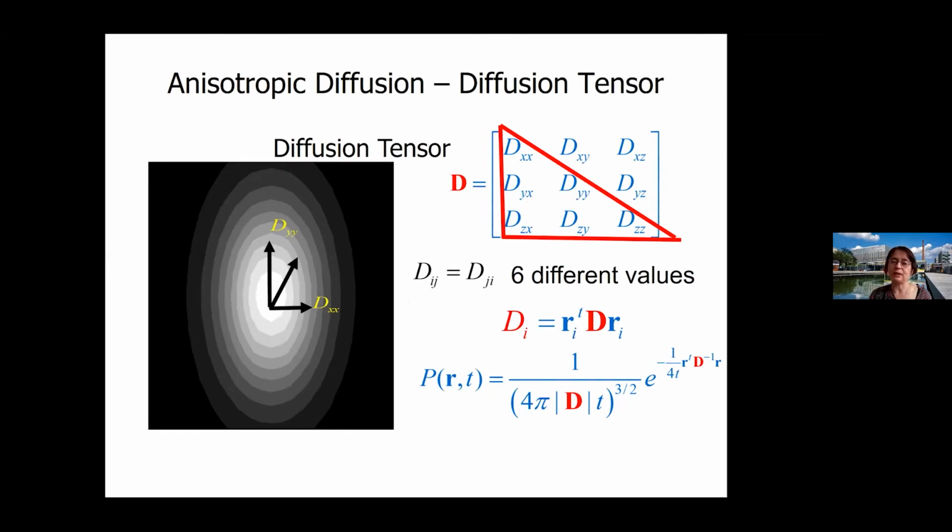So this kind of information can be represented with what is called a diffusion tensor. Instead of having all these directions, we can simplify that to a diffusion tensor. A diffusion tensor is a 3x3 symmetric positive matrix that represents the behavior that I'm showing to the left, the probability of the molecules moving a given distance after an amount of time.